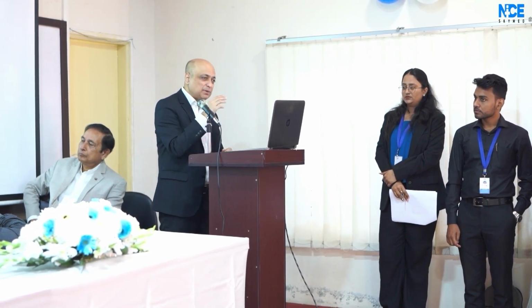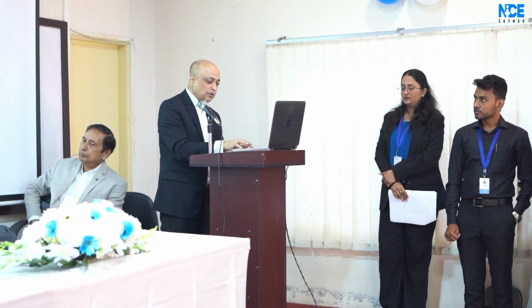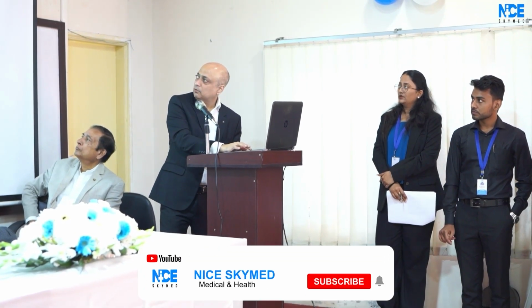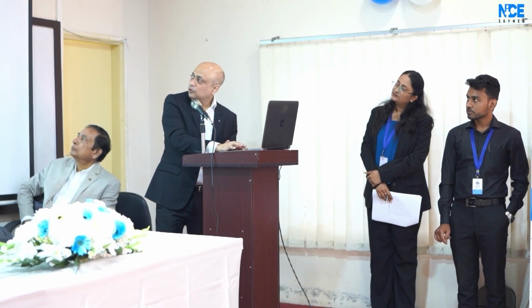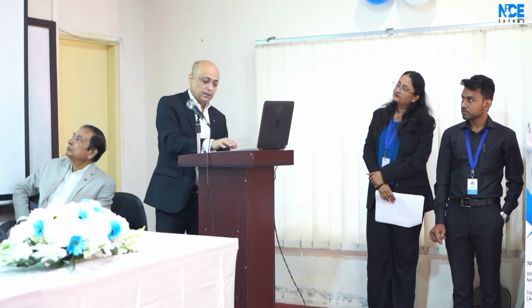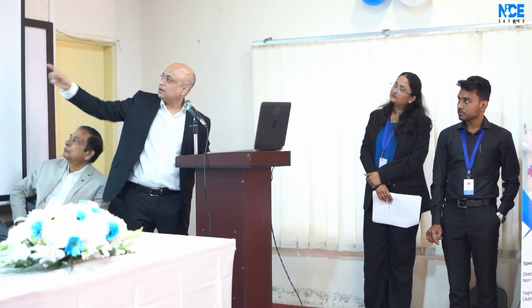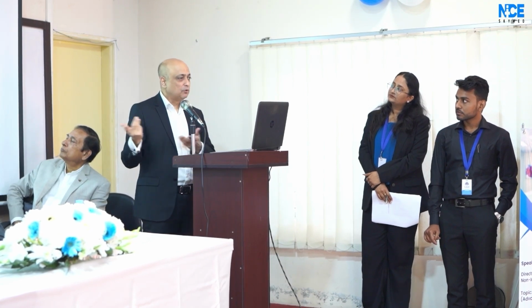People who don't want surgery, or those who are not eligible for surgery, like high risk patients, very frail patients, low ejection fraction, low pumping power, for such patients. So this is the block. This was an angiography. You see multiple blockages. All arteries are blocked. Then we put a wire in the LV. This is the left ventricle. You can see the door of the left ventricle. And then we put a wire. We place an impeller pump. This is called an impeller pump. The beauty is that after the procedure you can actually remove the impeller.